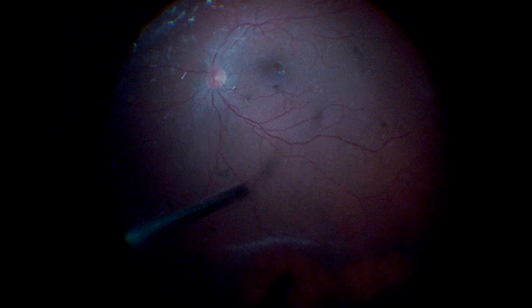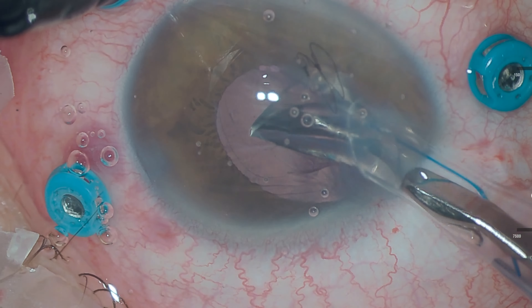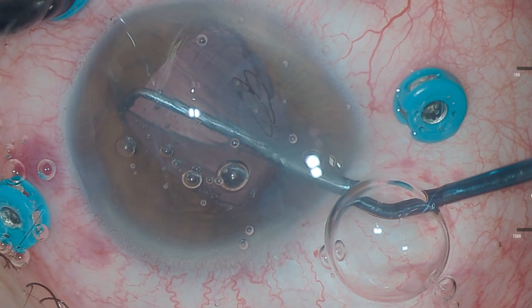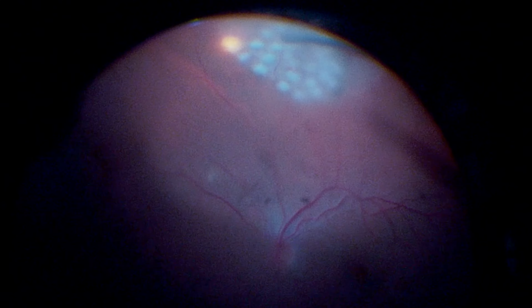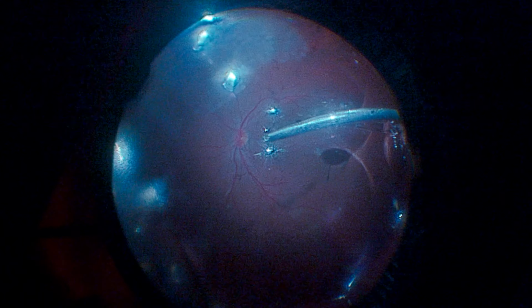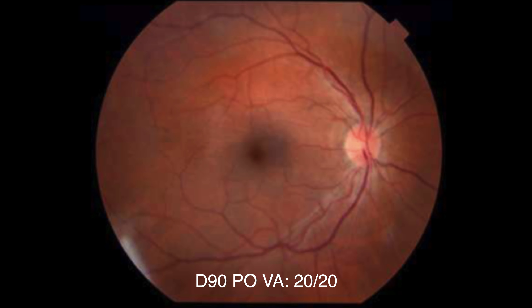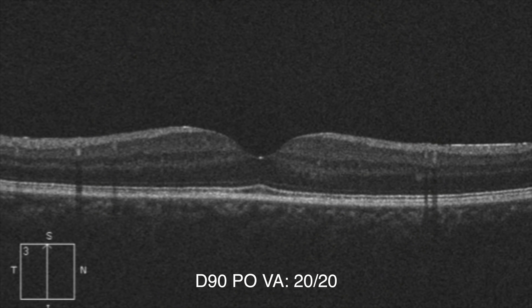Vitreous base shaving is performed and then a three-piece intraocular lens is positioned in the ciliary sulcus. Laser photocoagulation is performed in the inferior retina region and at the end of the surgery, the vitreous cavity is filled with air. We observe a good late postoperative result with complete visual recovery.